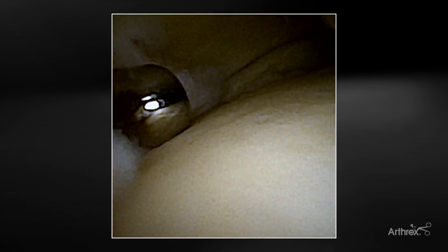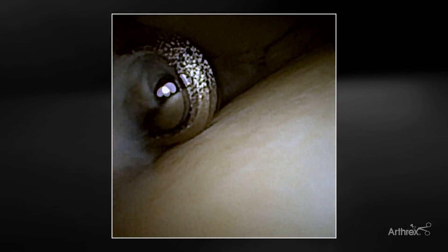We're inserting our Nano shaver, and we do have a little bit of some synovitis. I scope every ankle stabilization because they typically, nearly 100% of the time, will have synovitis. So we'll work some of this out. You can see the picture quality — this is cool technology, especially being such a tiny little scope to have that kind of quality, and the ease of just using this on the iPad. If I want to, I can turn the microphone on and tell the patient, 'This is all the scar tissue and inflammation you've developed over years of spraining your ankle.' You can see even though this saber shaver is small, it's still very aggressive and works nicely. We'll use it to show some diagnostic purposes as well.